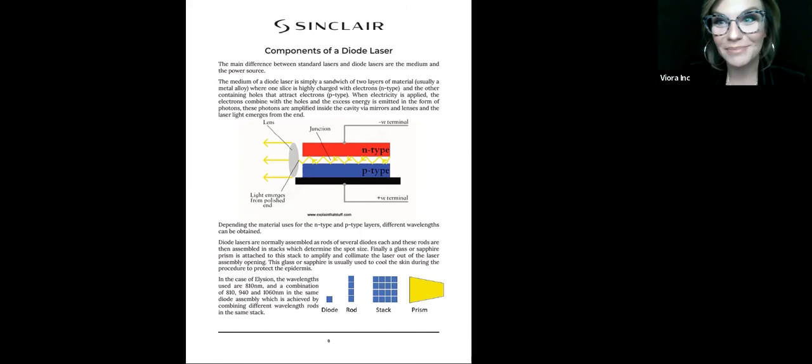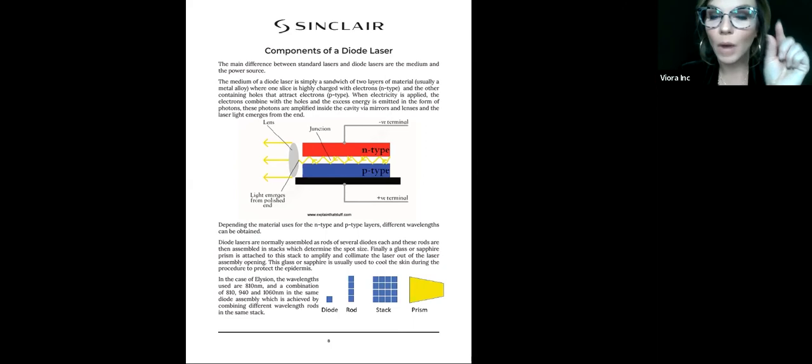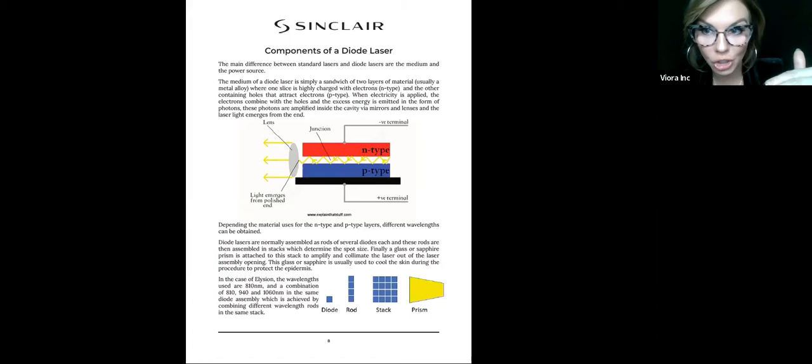Diode lasers are normally assembled as rods. So there's one little diode, and then they're put together, and that forms a rod of several diodes. And then they're assembled into stacks, and that's what determines the spot size that you're using. And then there's a glass, really it's a sapphire crystal. If you guys have our Viora IPL, same thing. It's a sapphire crystal that is cooled to keep the patient comfortable, but also keep the skin, the epidermis, safe.